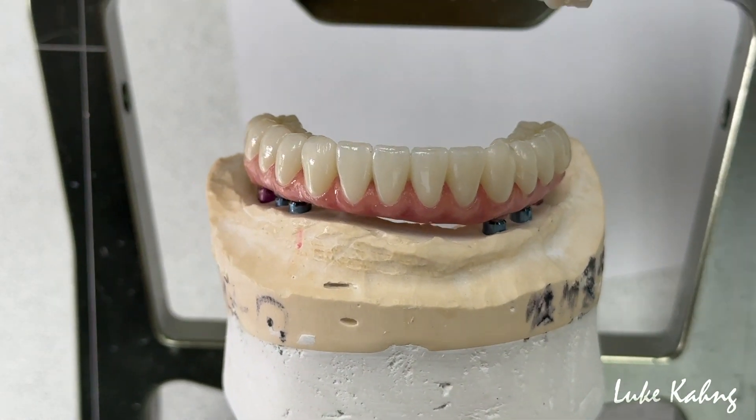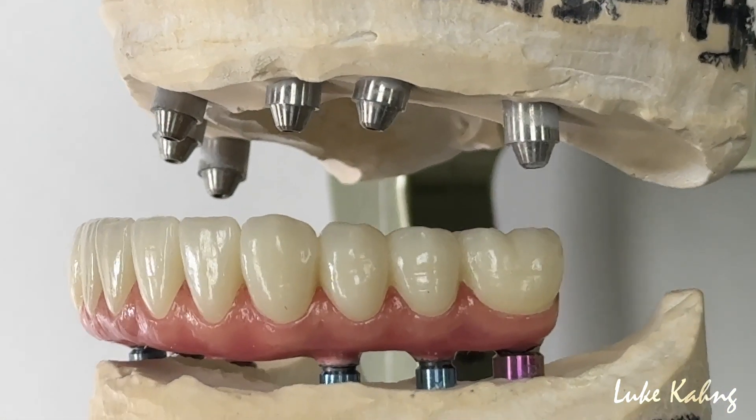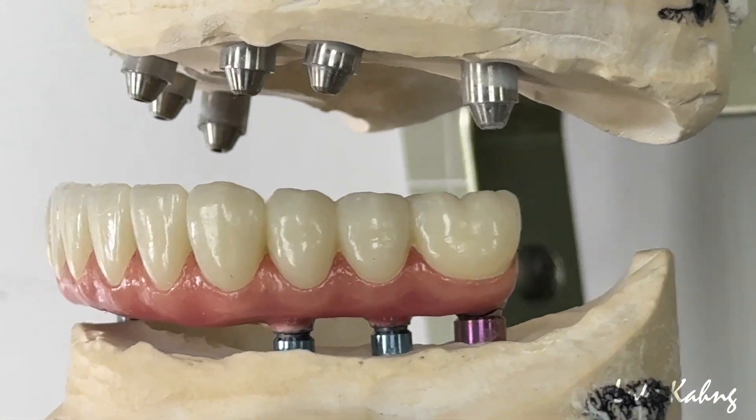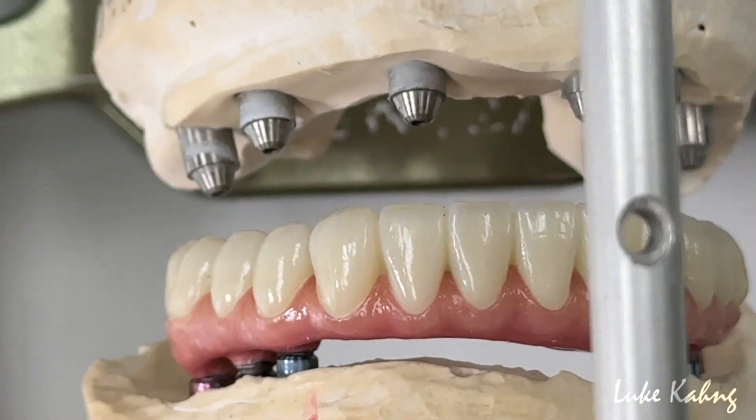Great case. Starting from Class 3, then make it Class 1 — another beautiful art. Not only thin the lower, but also change the top — a beautiful restoration.